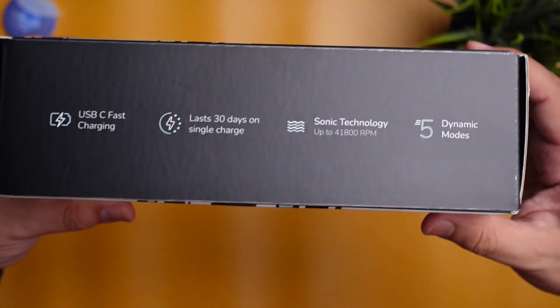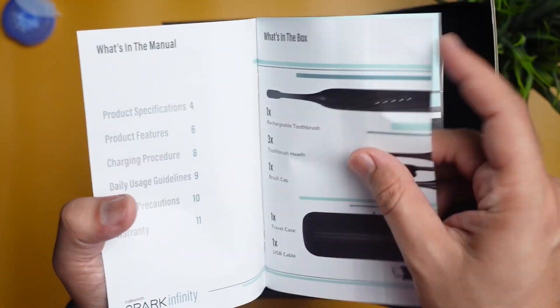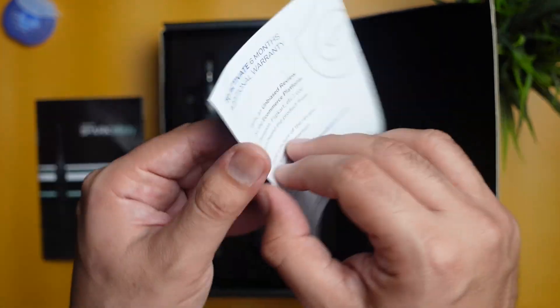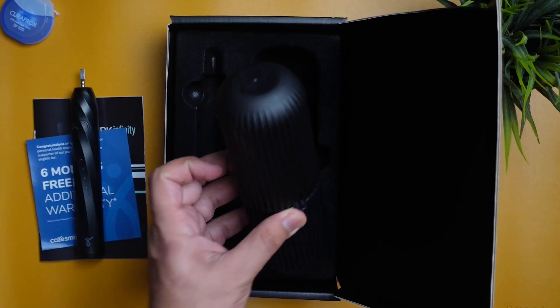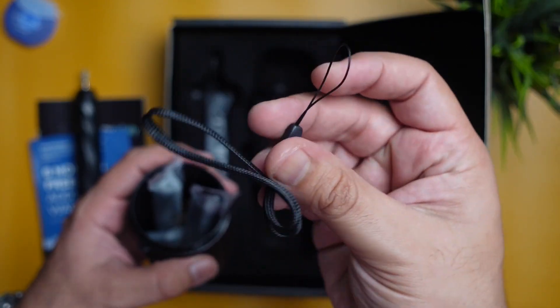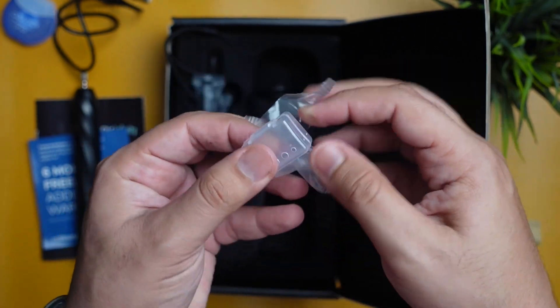The unboxing experience was quite good. You get the manual with all the instructions and info about the modes. You also get an additional six months warranty card. The box contains the brush handle, a case with three brush heads, a lanyard, a USB-C charging cable, and a brush head cover.